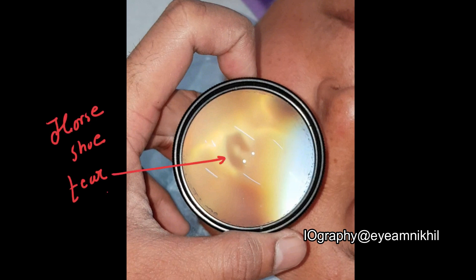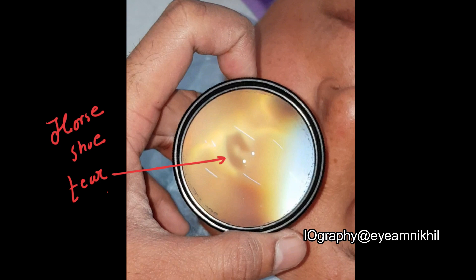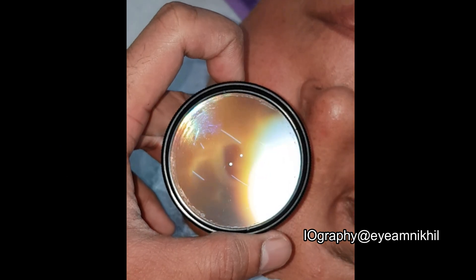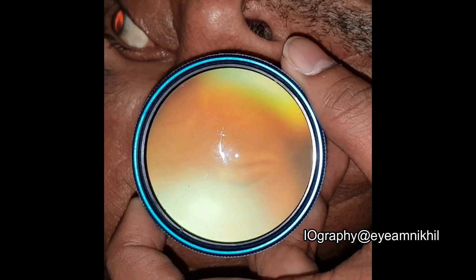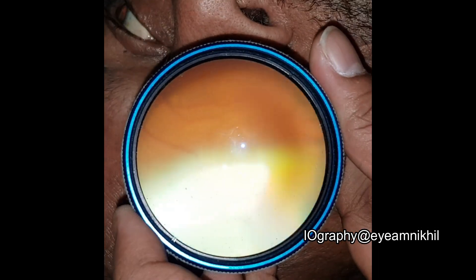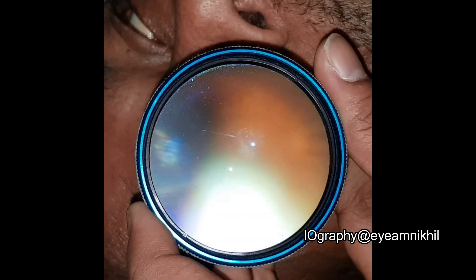This is a temporal horseshoe tear in the left eye of the patient. And this is a superior nasal horseshoe tear in the right eye.